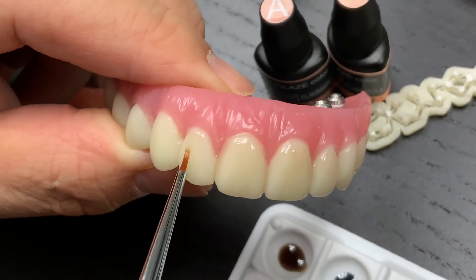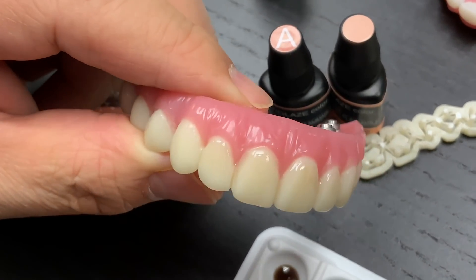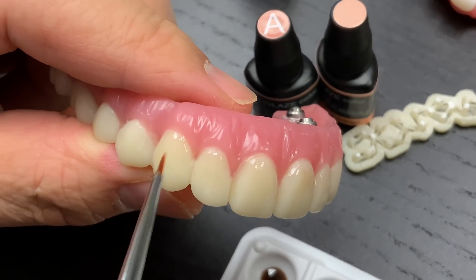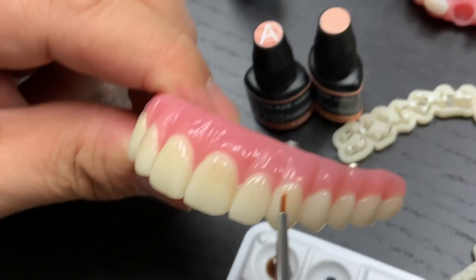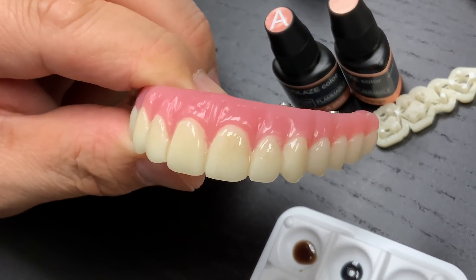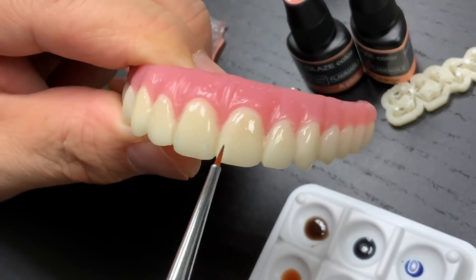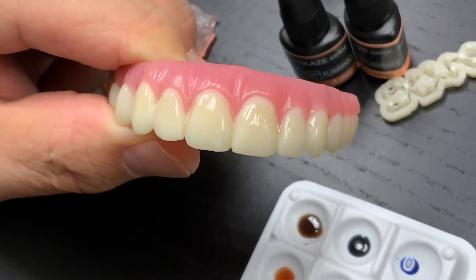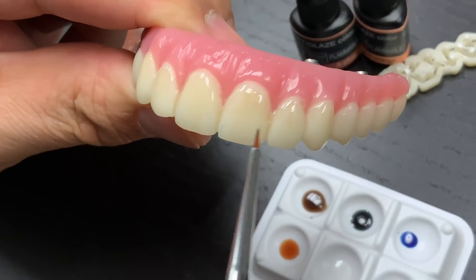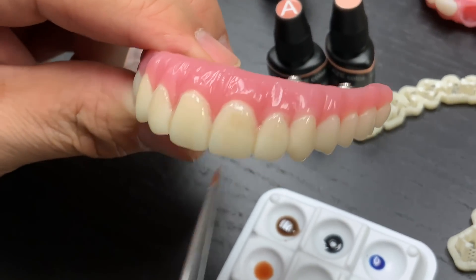Basically, I put the dentine applied on top of the facial, all the way up. The canine is a little bit darker, so you can make a slightly darker cervical area. Then I'm using blue just a little bit in between the mesial and distal corners to increase translucency — the other side too, just subtle. Don't add too much. The irregular color should be okay.